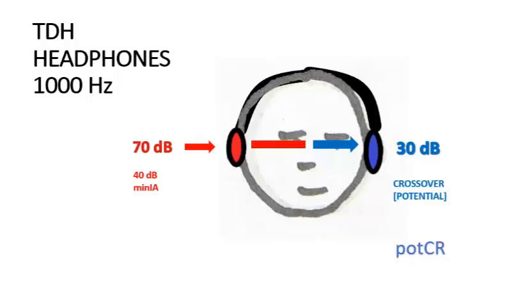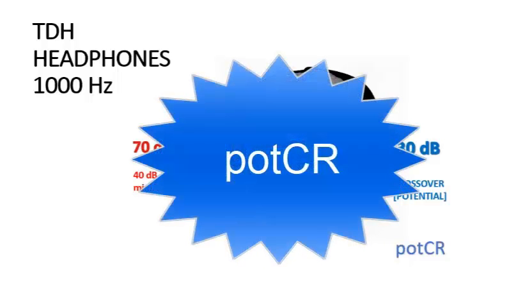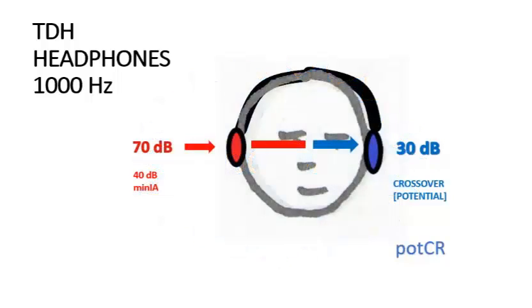For audiometry, we may not know a specific attenuation for every person, but we do know the minimum possible attenuation for that particular device and that particular frequency of the tone. So we can predict how much sound might cross to the other side. This is an important process in deciding when masking is necessary.